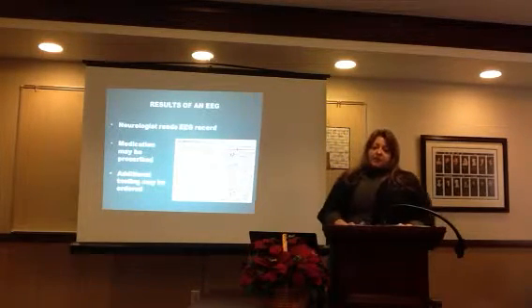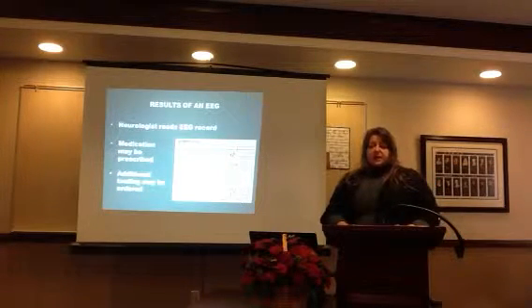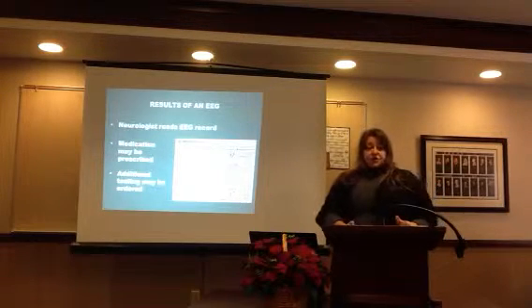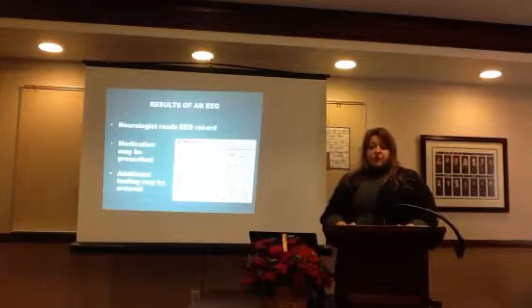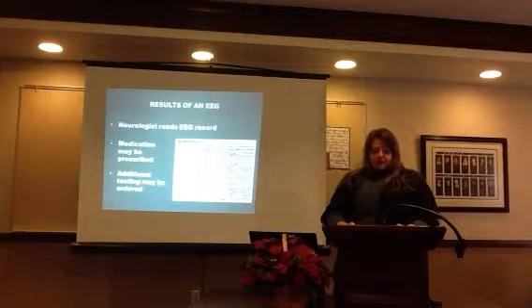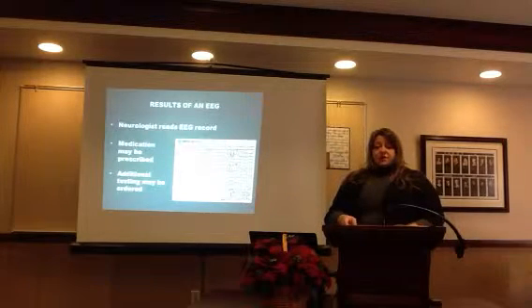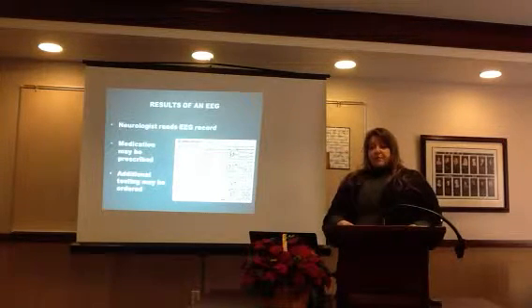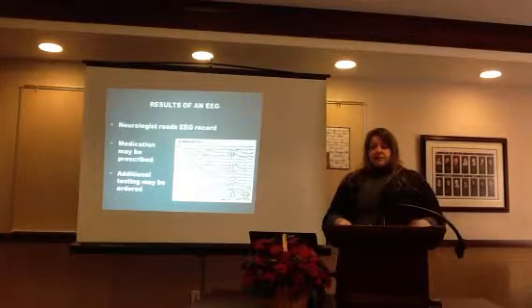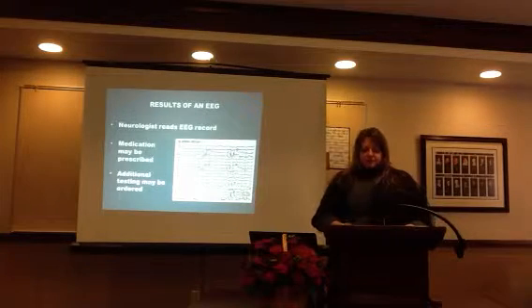Now, when you or I look at an EEG recording, it may just look like a bunch of squiggly lines. But to the doctor, he's trained to read the recording and to determine whether or not there is a seizure disorder. In the case of a confirmed seizure disorder, the doctor may prescribe anti-seizure medication and then monitor that treatment through periodic office visits with the patient.